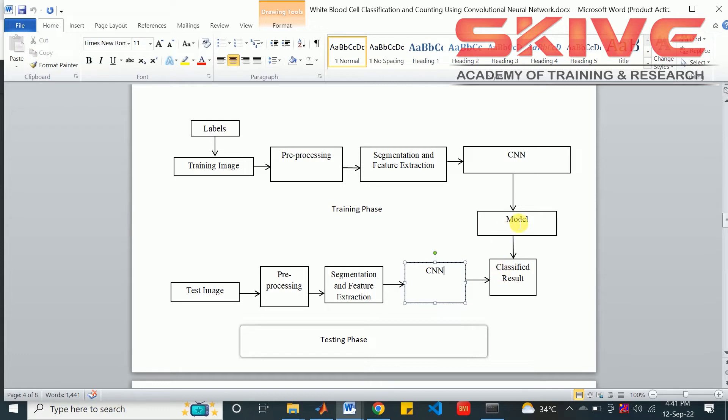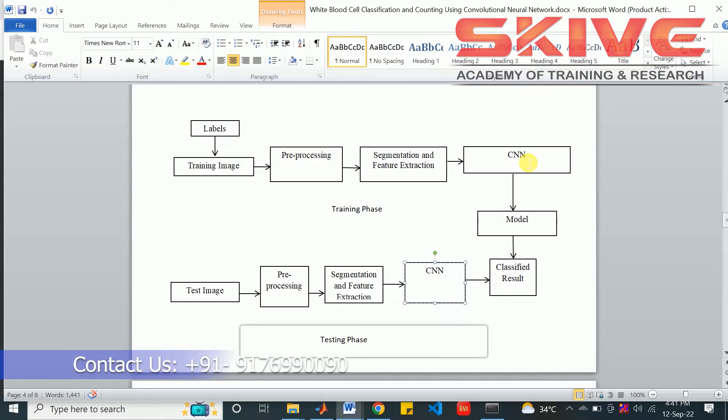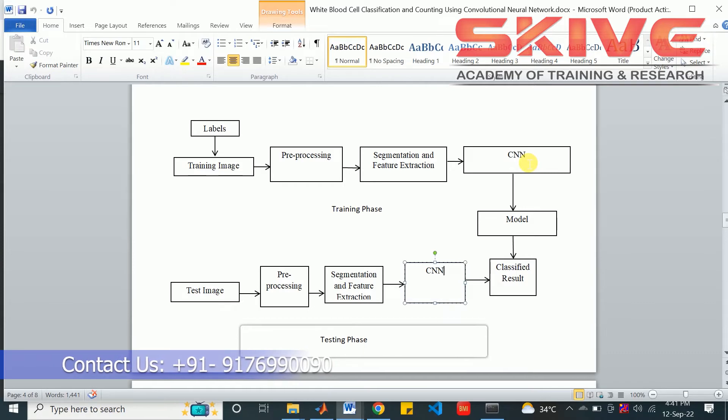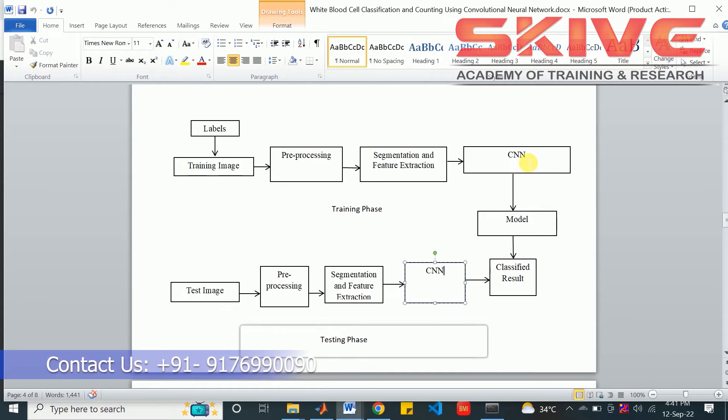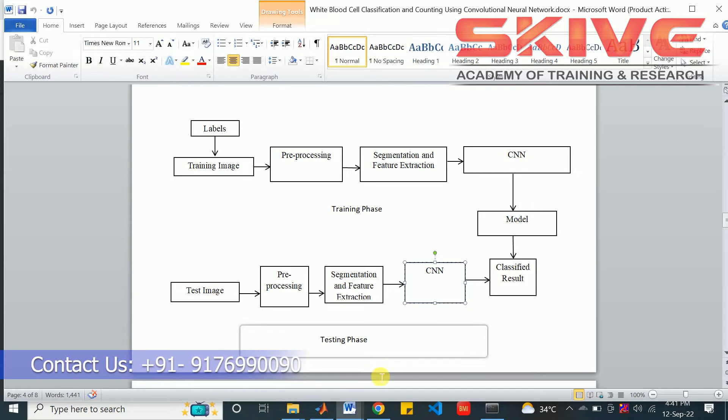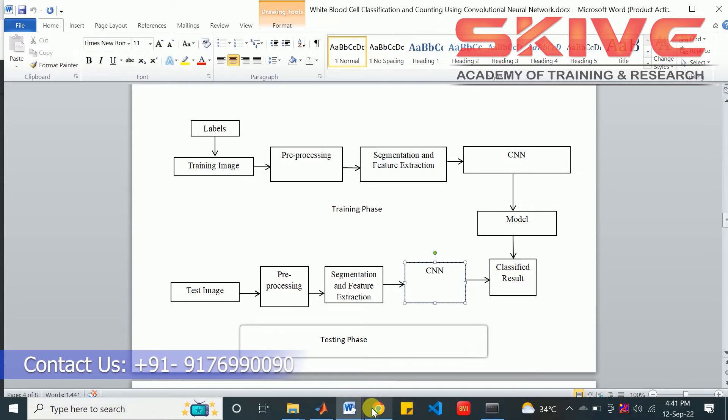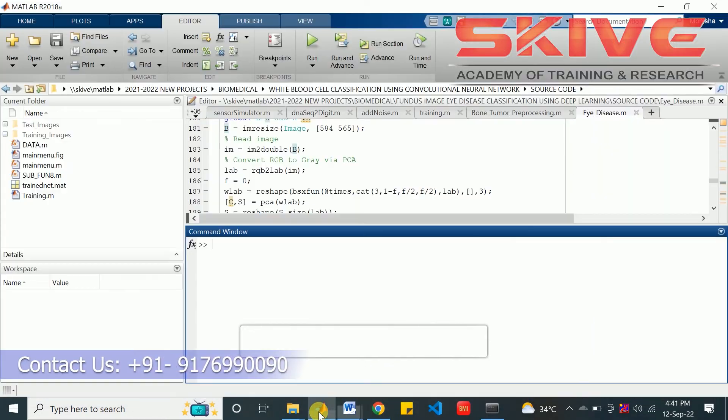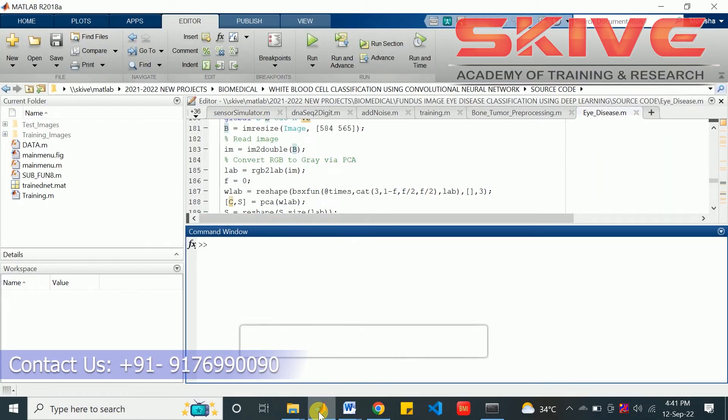With this result we can classify which type of blood cell we are giving as input. It will be useful for counting and other processes for finding the illness in the blood and our body too. So now we can see the implementation.